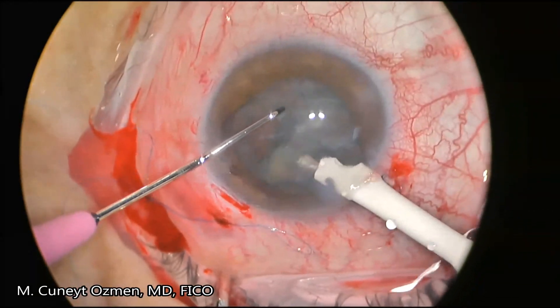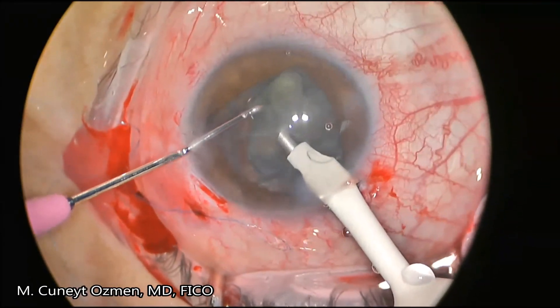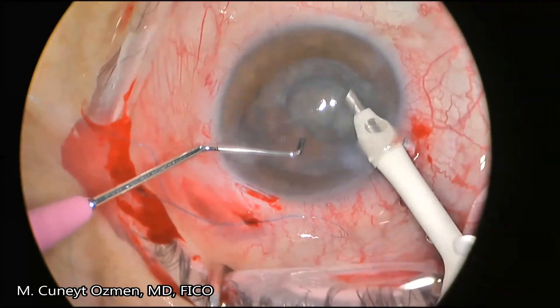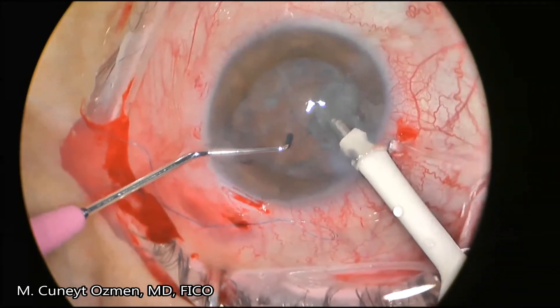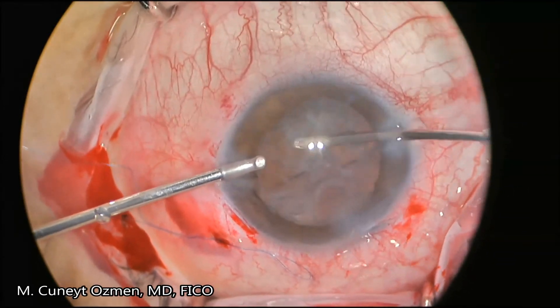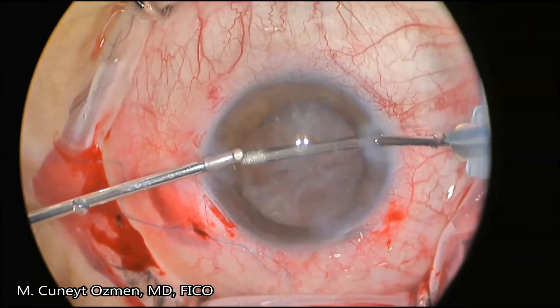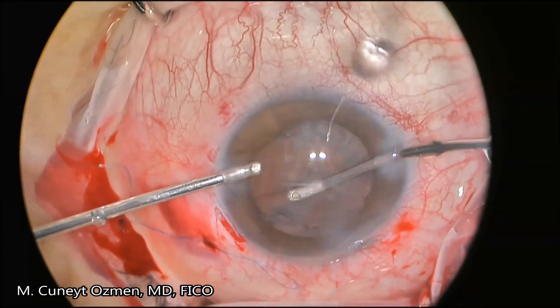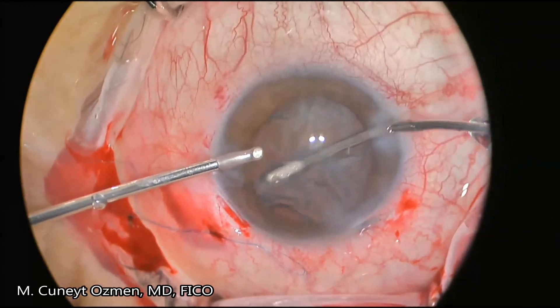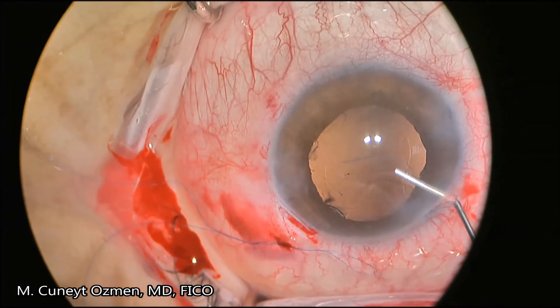After removal of the nuclear and epinuclear material, we move forward with irrigation and aspiration to remove all the remaining cortical material. One should be very careful about irrigation and aspiration of the cortical material while there is a ring in place, because the ring is pushing the cortical material toward the equatorial region of the capsule.